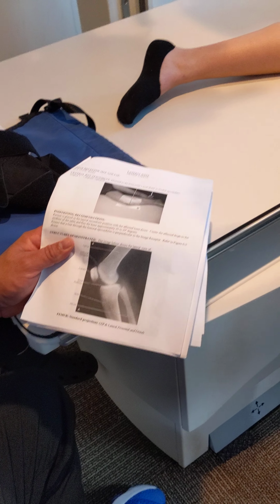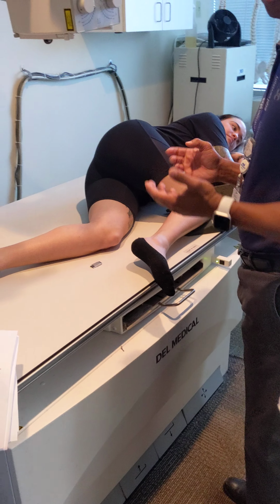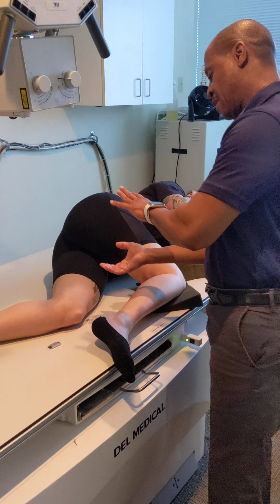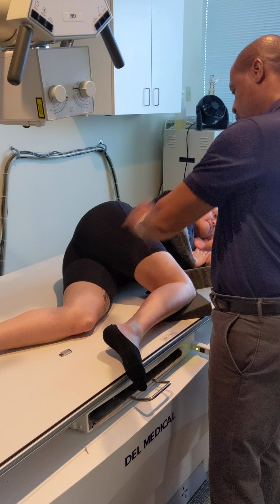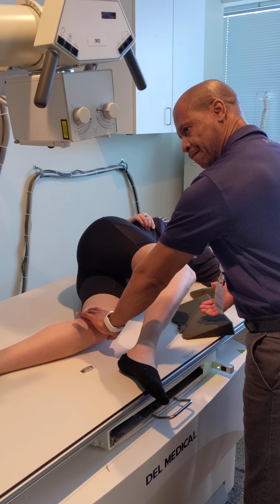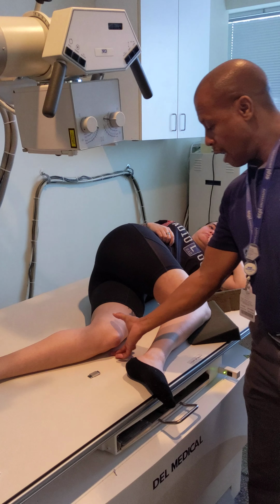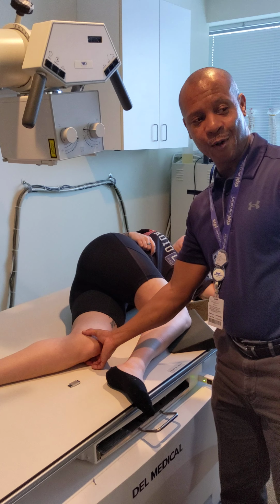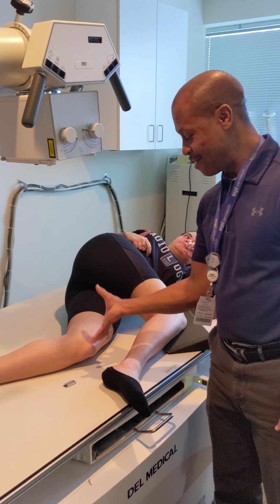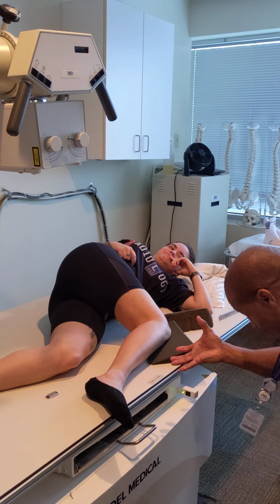Okay, right here. But if she's rotated improperly, one's going to move forward, one's going to move backwards. That's a huge issue when it comes to shooting knees. The patient either rotated too far forward, okay, go relax, now roll back that way, or they'll roll too far back. And you're just kind of feeling them both at the same time? Well, normally I can feel hers because my hand can fit. Now if you meet somebody who's got a knee about like this big, I'm not going to be able to do that. A lot of the time, I've got to eyeball it.